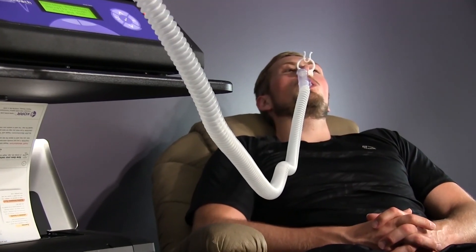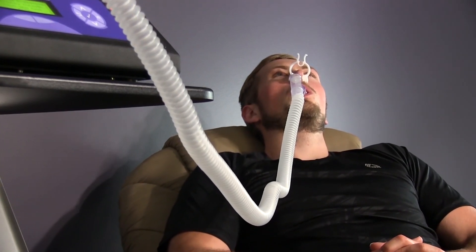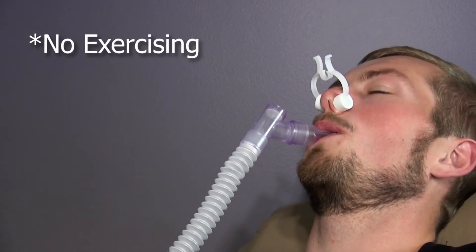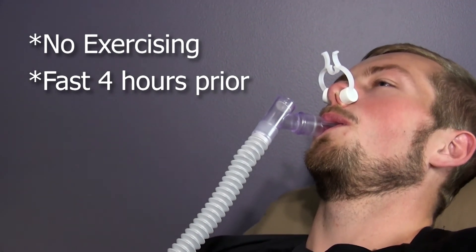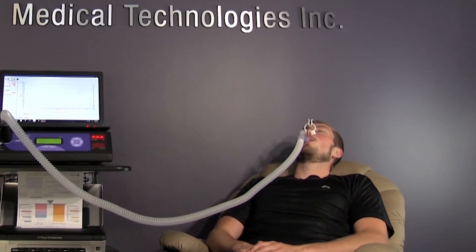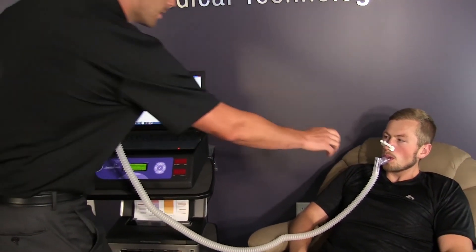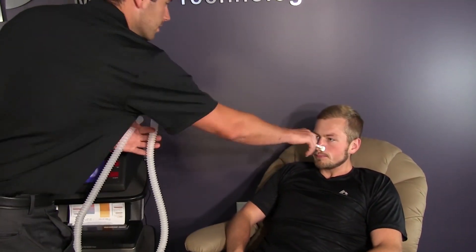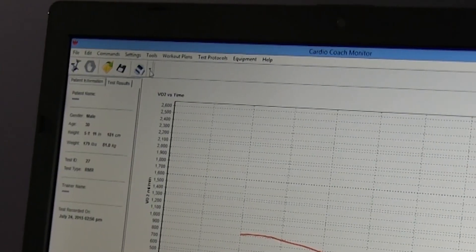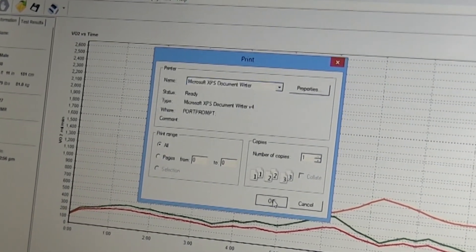Click Start and have your client breathe in a relaxed manner. Test results will be most accurate if the client comes prepared by not exercising the day of the testing, fasting 4 hours prior to testing, and avoiding stimulants. When the test is complete, the unit will beep. Disconnect the MetaBreather tubing and throw it away. You can print the results from the software by clicking the Print icon. After the results have printed, you will be ready to interpret the results for your clients.